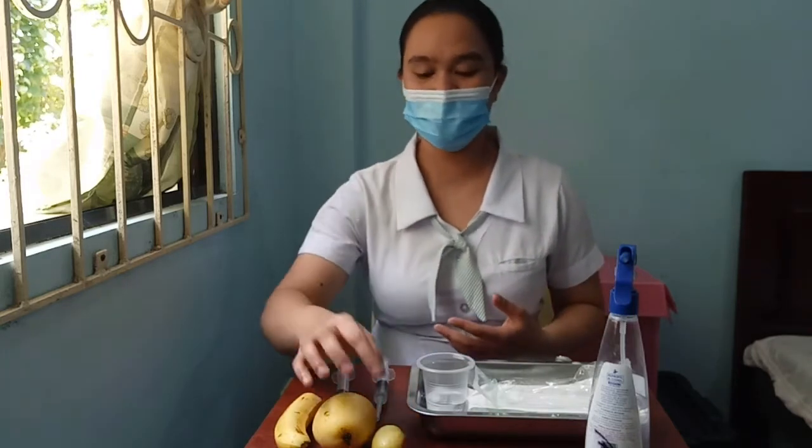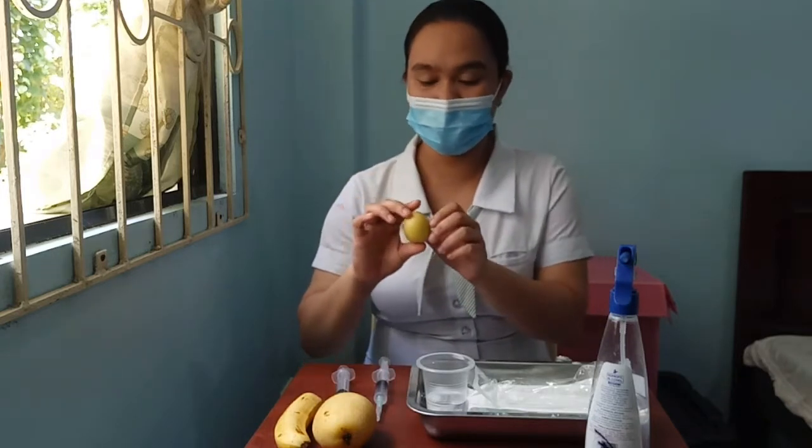Next is introduce yourself and verify the client's identity. This ensures that the right person receives the medication. So for example, our client is this tomato.